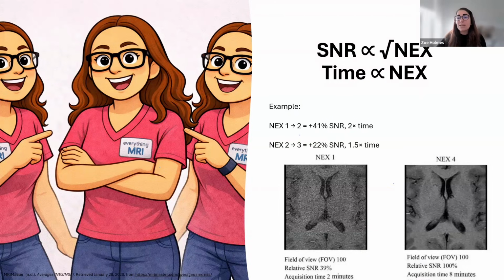So the practical recommendation is, if you need SNR but your time is limited, consider whether you are unnecessarily spending your signal to noise elsewhere. If your parallel imaging factor is too high, if your bandwidth is too high, if your thin slices are too much beyond the clinical need, have a look at what you actually need to answer the clinical question. Then the best move is to stop unnecessary signal loss rather than trying to buy back your SNR with time.